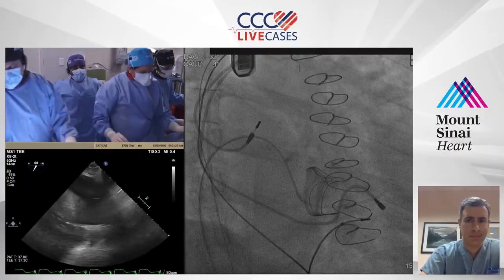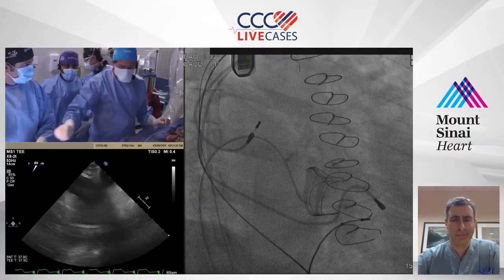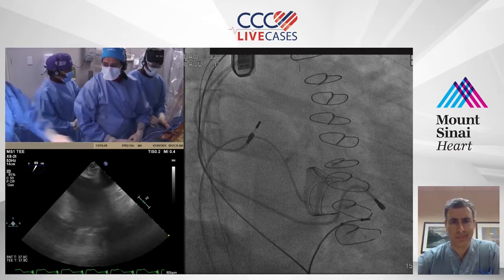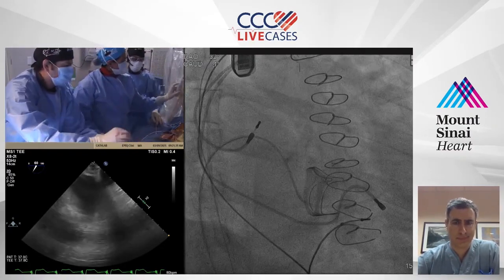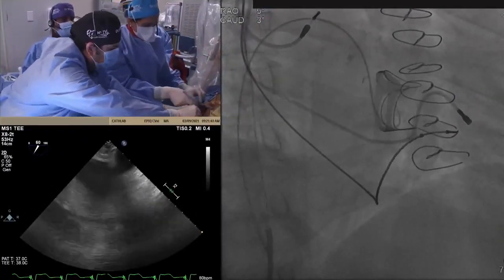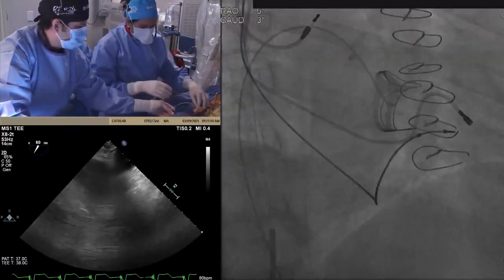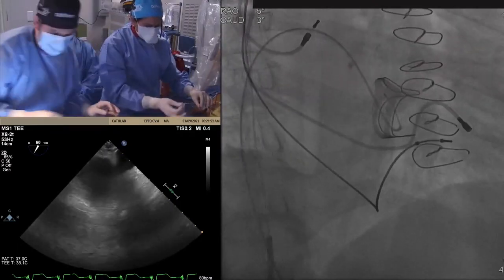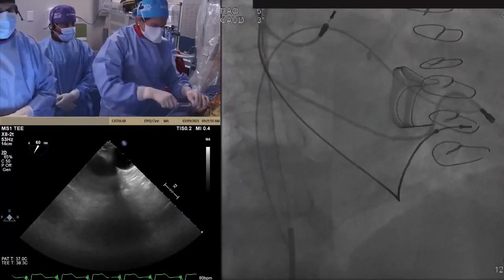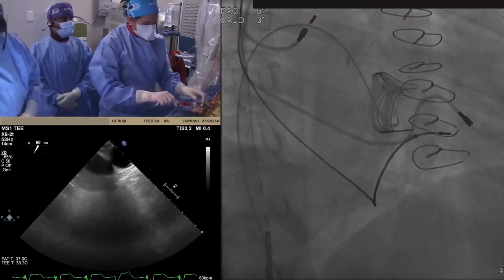This patient also has a pacemaker lead, and the pacemaker lead was through the original valve. It was repositioned, right? It was taken out. Yes, that's right. So this patient had a lead across the prosthetic valve before. We discussed with our EP colleagues that we don't want to crush the lead or cause a paravalvular leak because of the lead. We decided to extract the lead, but one elegant way our EP colleagues did it, rather than removing the generator and the lead itself, was to pull it into the IVC, which you see here in the fluoro.